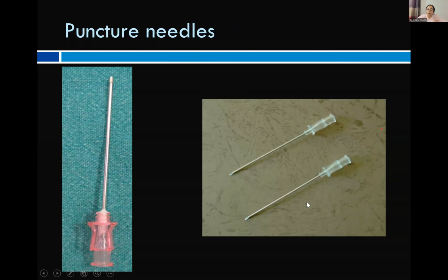And these can be either single part needles, which means it's a hollow needle, which has only one component, which is the needle, which is connected to a hub. They usually have a beveled edge on the other end, and they are most commonly used for a single wall puncture. That is when only the anterior wall of the artery is punctured. Then we have bipart or two-part needles, which means that there's an inner stylet and an outer sheath or outer shaft of the needle, and inside this we have a stylet which does the cutting. And these types of needles are most commonly used either for drainage procedures like the Chiba needle or the spinal needle, or for vascular access if we are doing a double walled puncture.